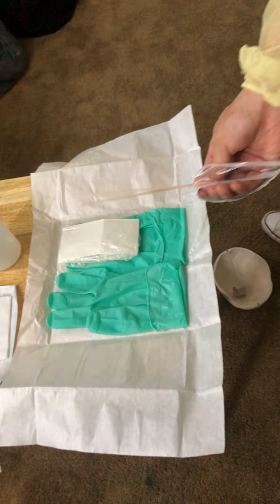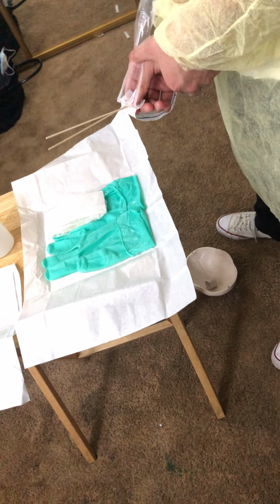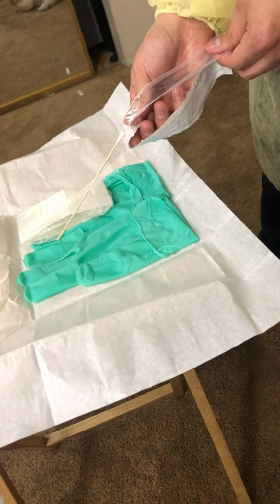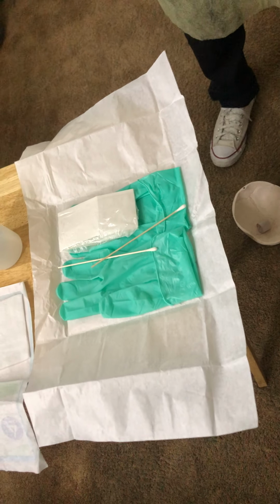Open them up carefully. There we go. As you can see there, they're both sterile. They haven't touched the 1-inch border. That one looks like it's touching the 1-inch border, so I'm going to be safe and not use it. Just not going to take any chances.